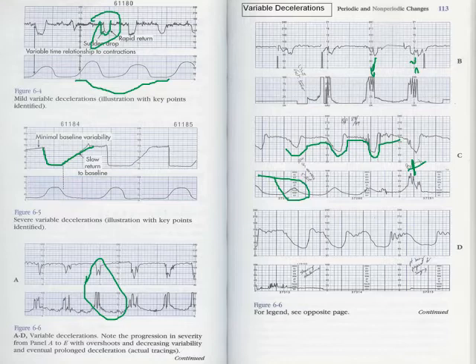And then down here, I can't tell what she's doing with her contractions, so these I'm not happy with. Look, they go all the way down to almost 60. And look at the other part. What do you see minimal of? Variability. That minimal variability and these long, slow recoveries, this is a bad thing. This baby needs to be delivered. Oh, look, it says right here, patient being prepped for surgery. Hooray!